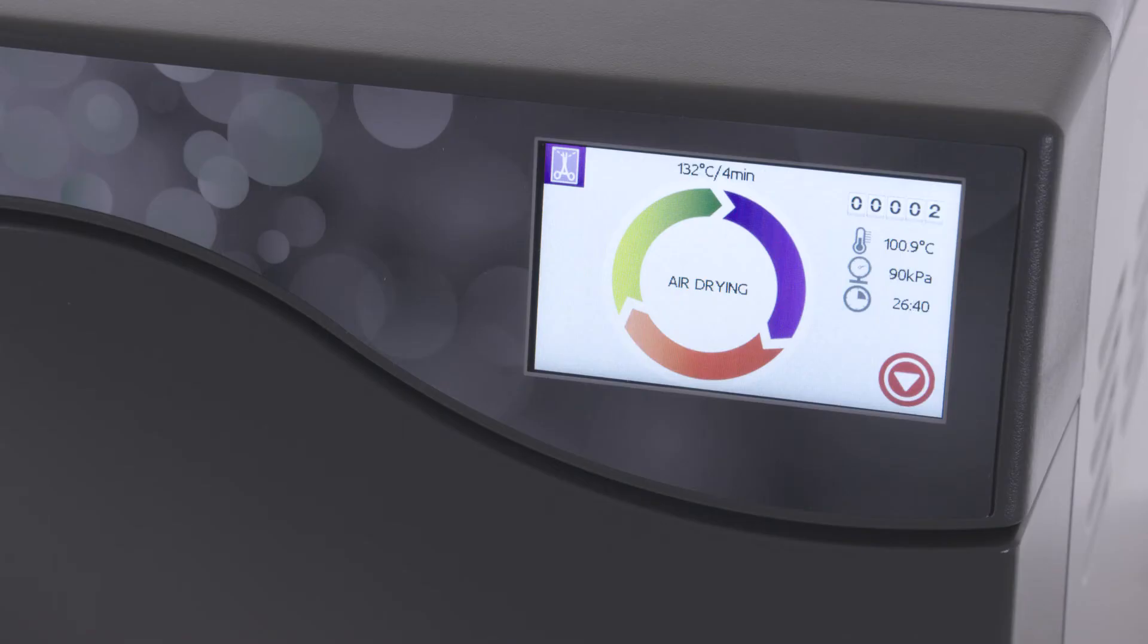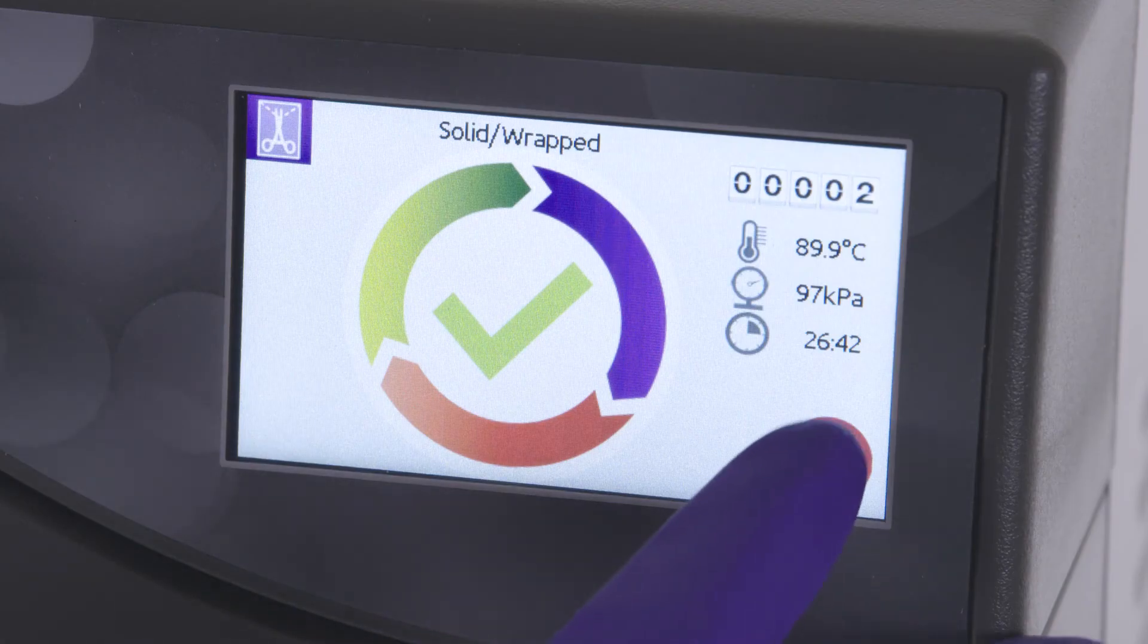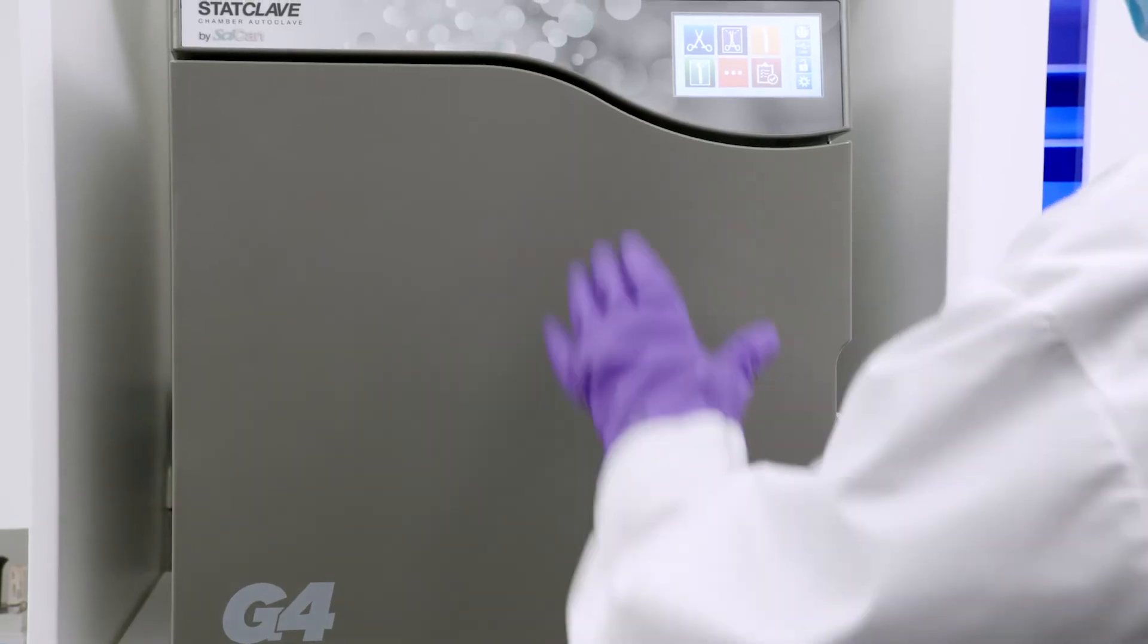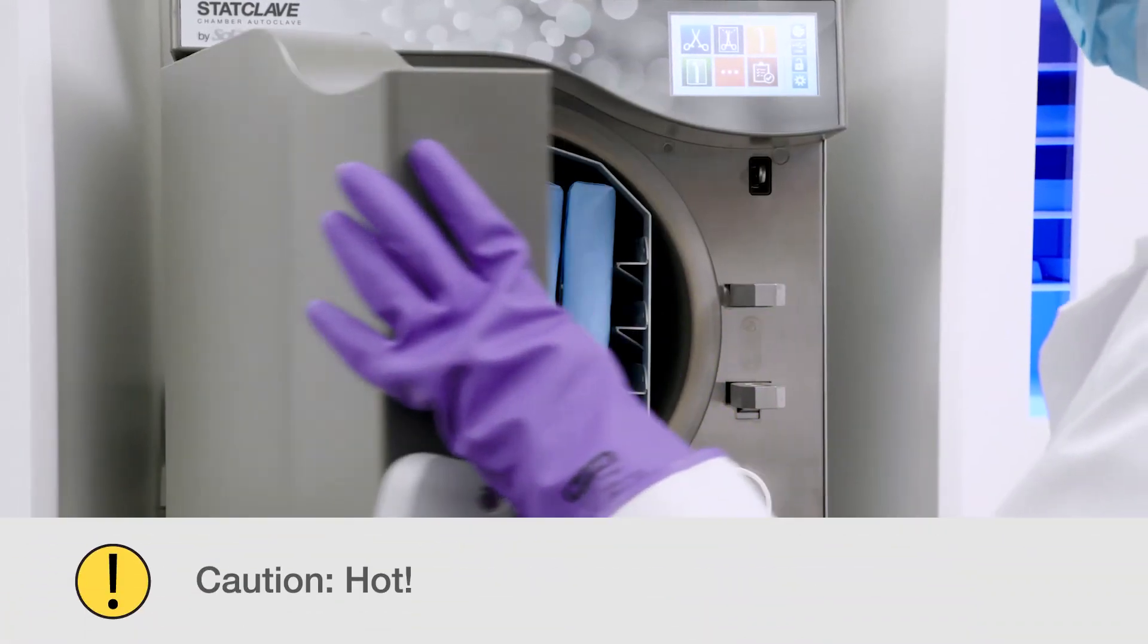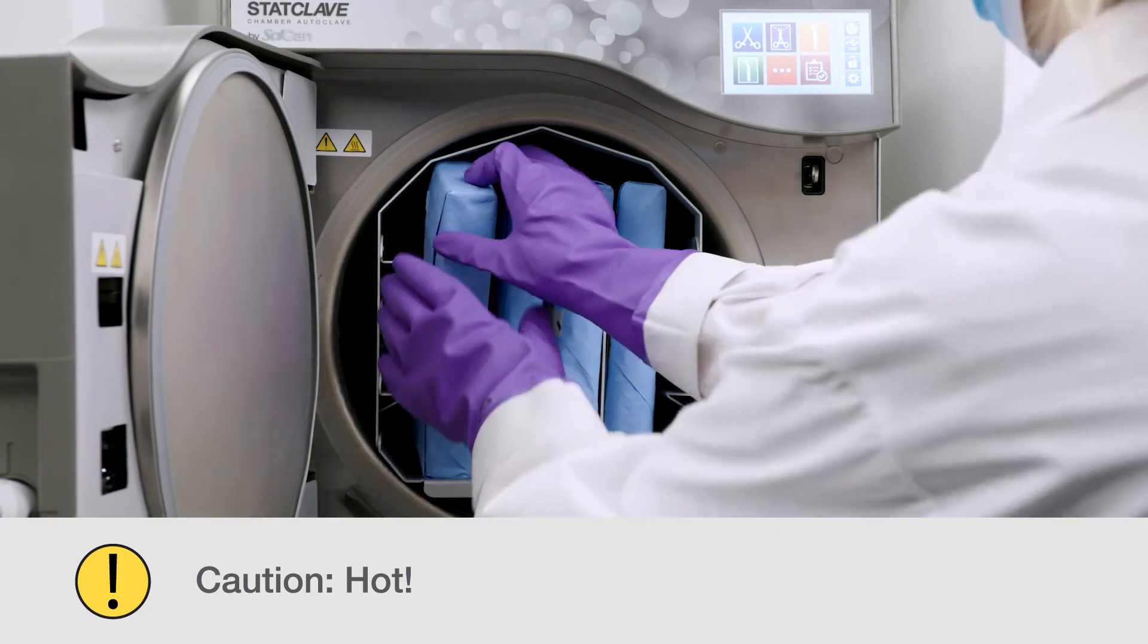When the sterilization and drying cycles are complete, and the chamber pressure returns to preset safety limits, the screen will give the message, cycle complete. Press the stop button and open the door. Carefully retrieve the sterilized material. Caution! Contents may still be hot.